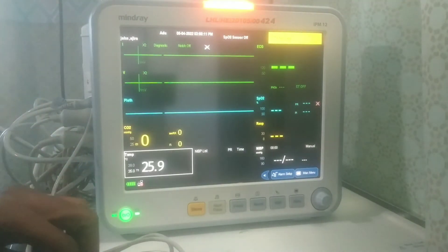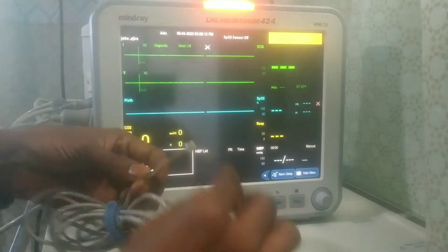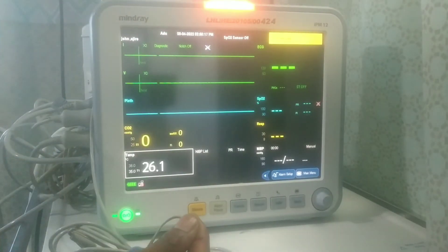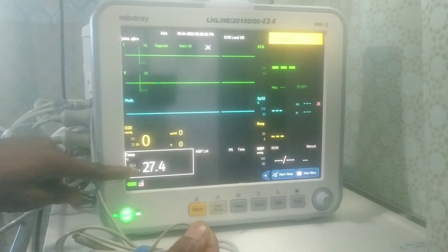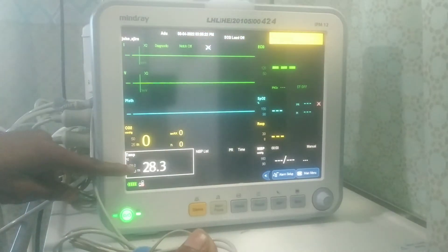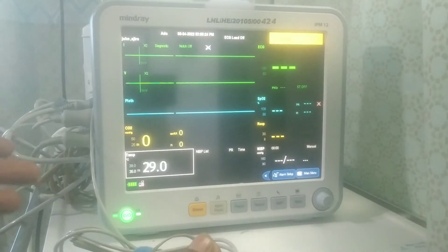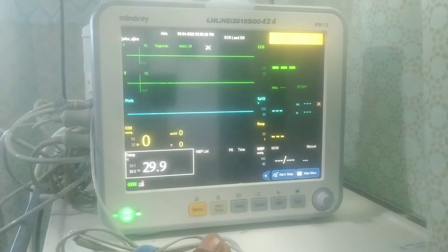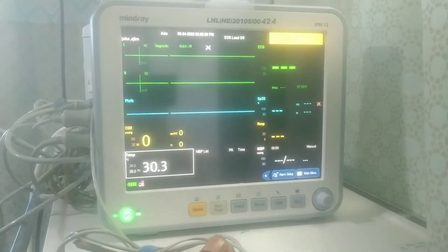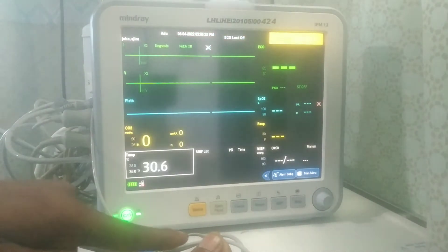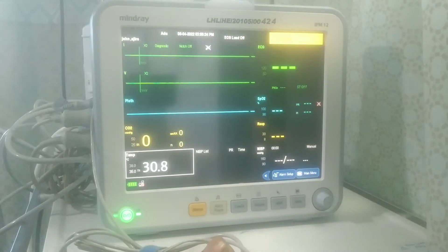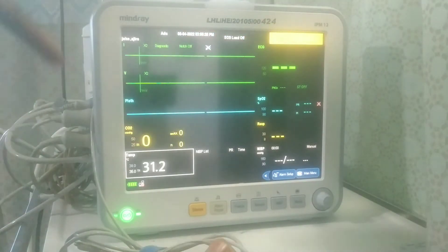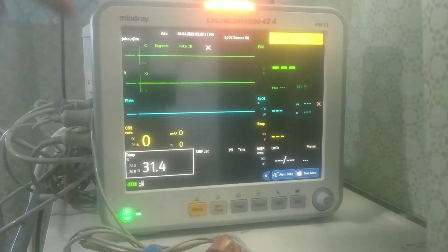I can now place my hand on the probe — this part goes to the patient, so if I hold it here, you can see it's increasing. This part is where you attach to the patient you want to monitor the temperature. You attach this part to the patient's body and make it firm there, and it will keep reading and displaying the patient's temperature.